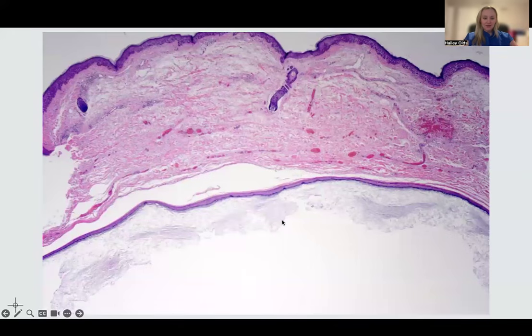Okay, next, you aren't seeing the whole lesion here, but give it your best guess. So up here we have normal epidermis, normal dermis, and then we have the epidermis again, and we have a lot of this loose, flaky keratin. And you have to imagine that this thing would go around and form a full circle. It's just hard to get on one slide here.